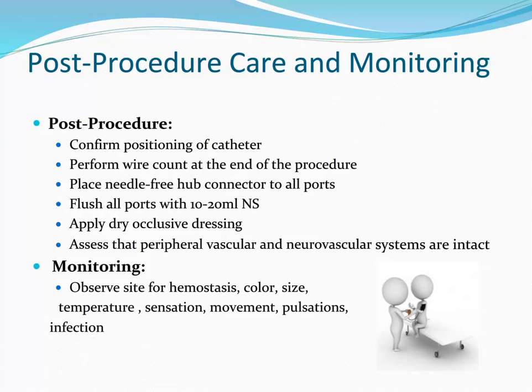If there is any concern that the blood may be arterial, hook it up to a transducer to be sure, and if not an arterial waveform, send off an ABG. This may sound unnecessary, but many of our sickest patients are very hypotensive and don't always have high pulsatile pressures. So there are instances when this may be necessary.